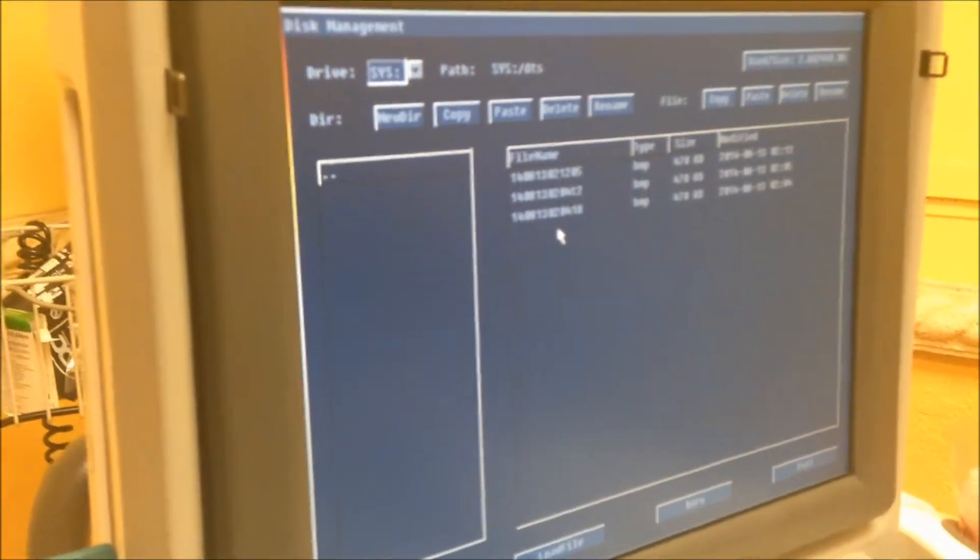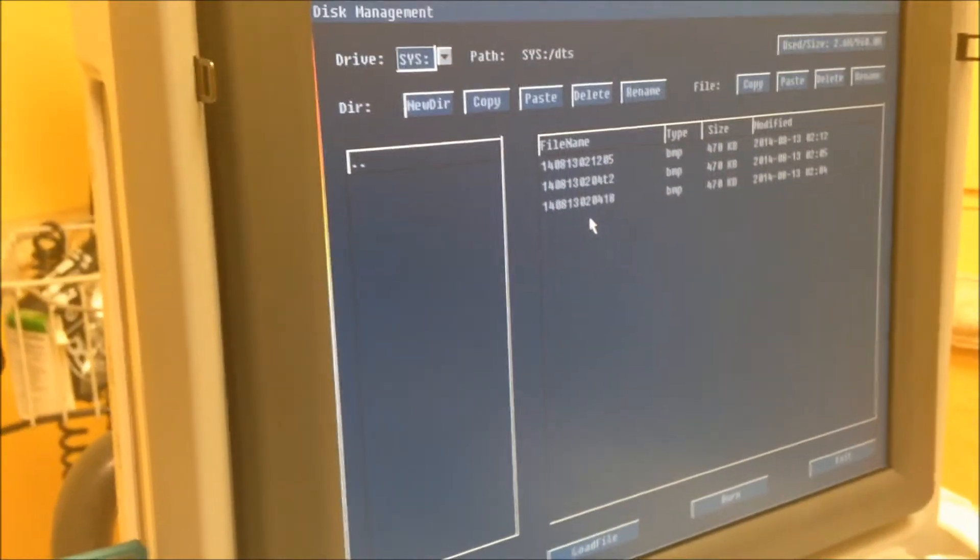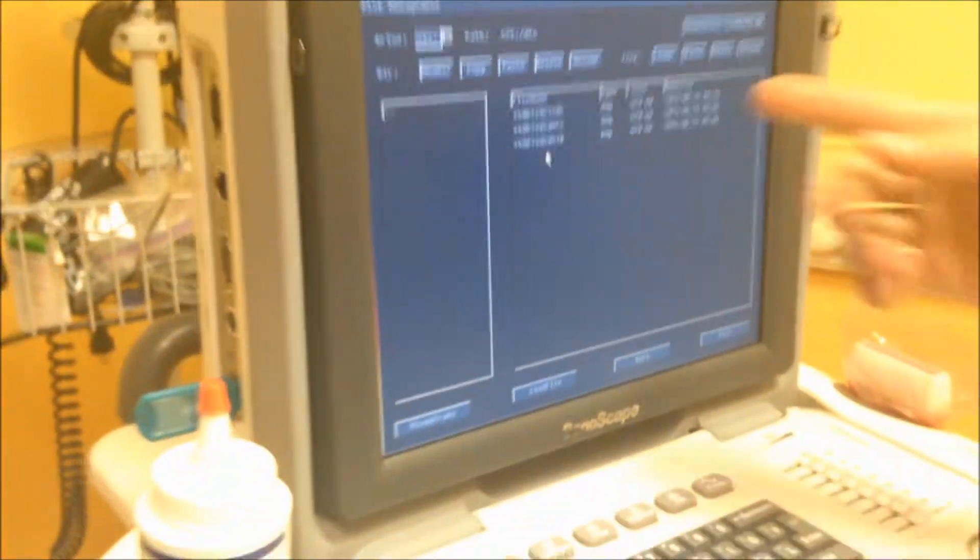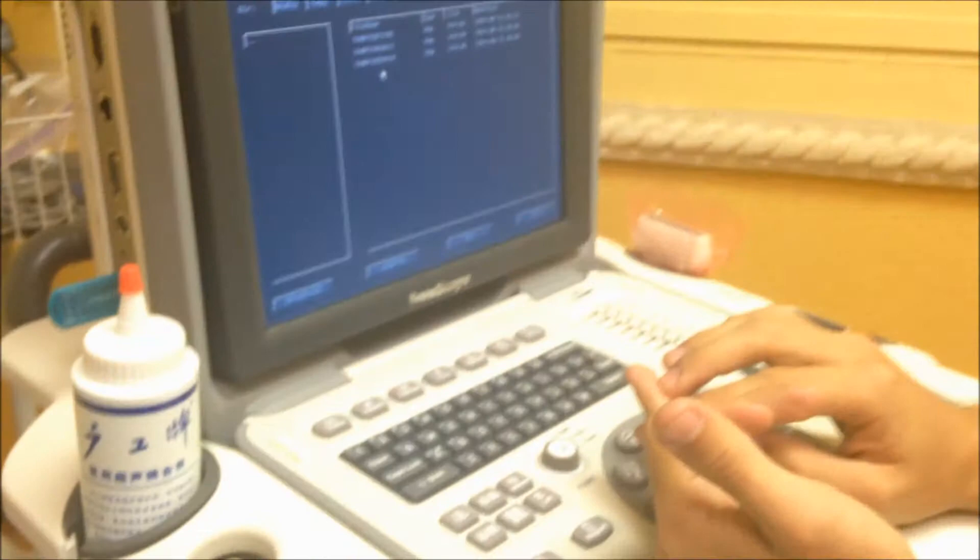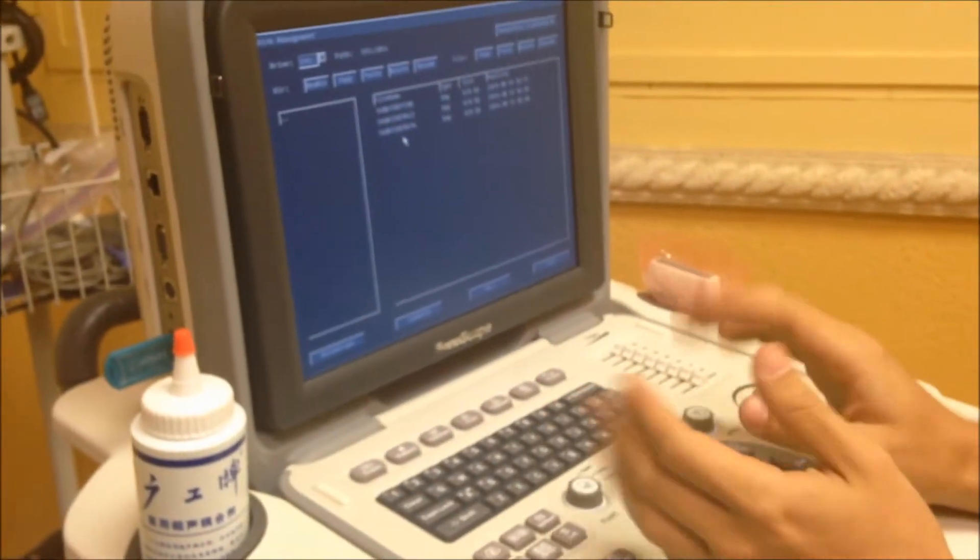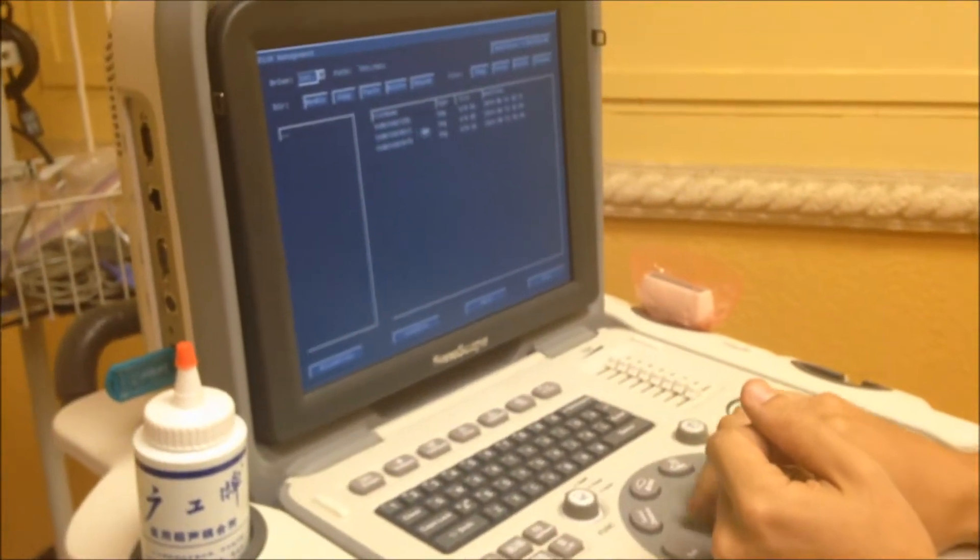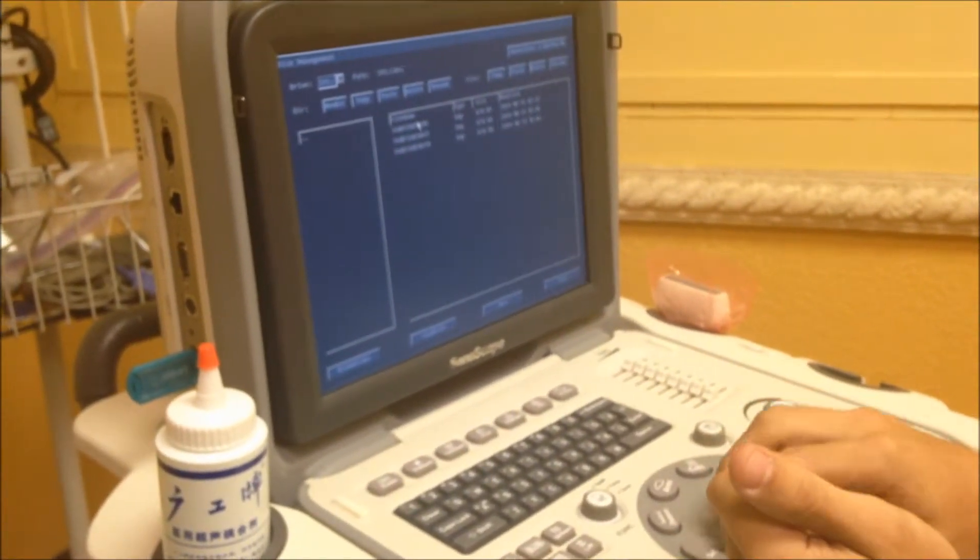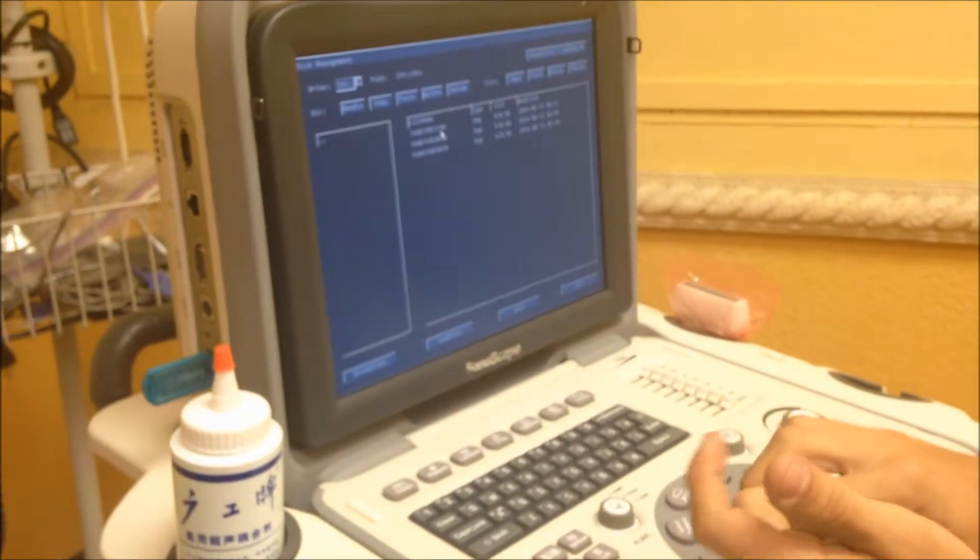Basically, you have three other ways of doing it. You can actually save it as a JPEG, bitmap as it is right now, or DCM for DICOM. So we're actually going to start doing this.